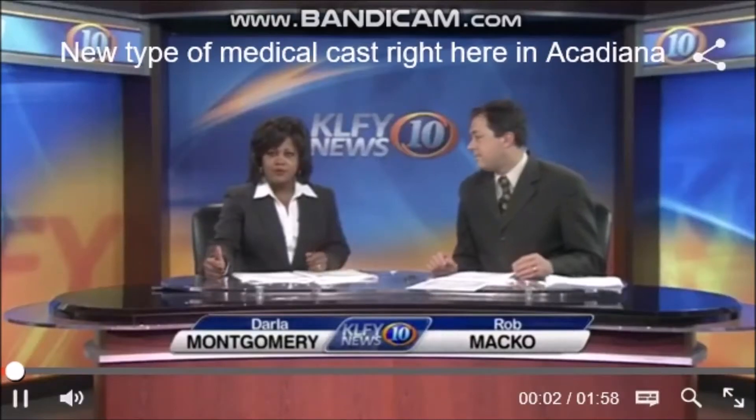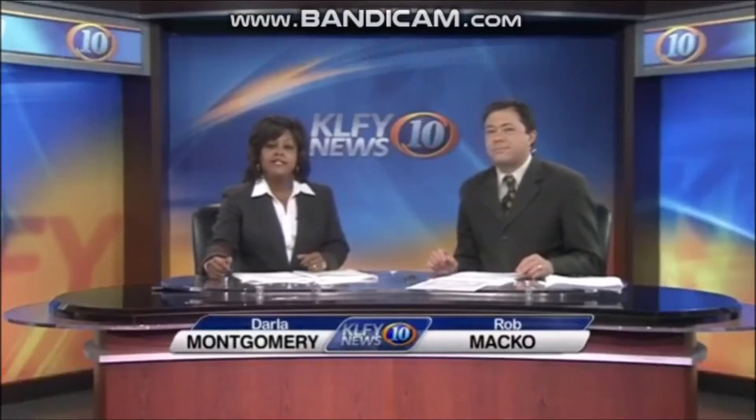A waterproof cast is being used to treat certain fractures right here in Acadiana. News 10's Brooke Silverang tells us all about it. There's an alternative method where you can have a waterproof cast, and you can get that here in New Iberia.